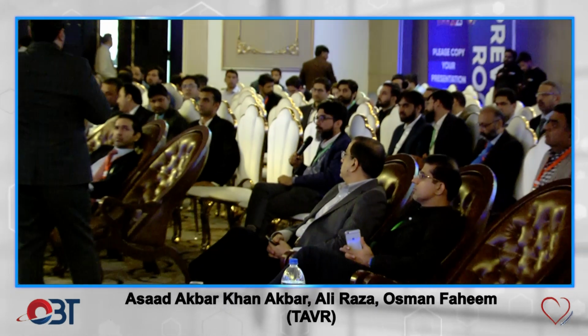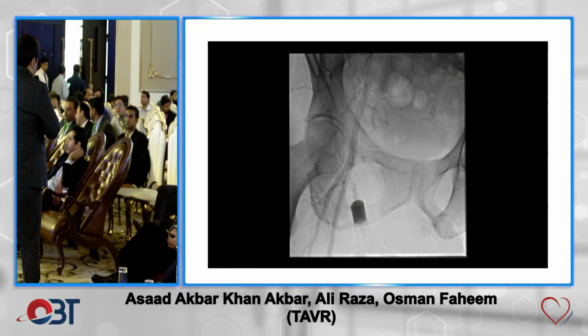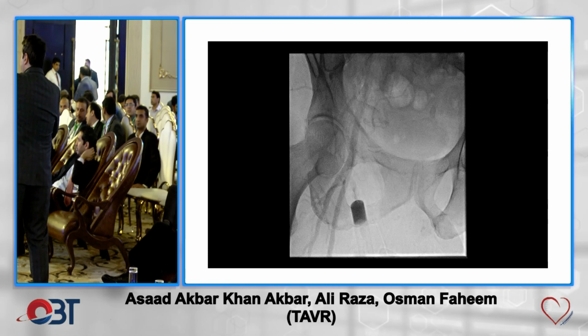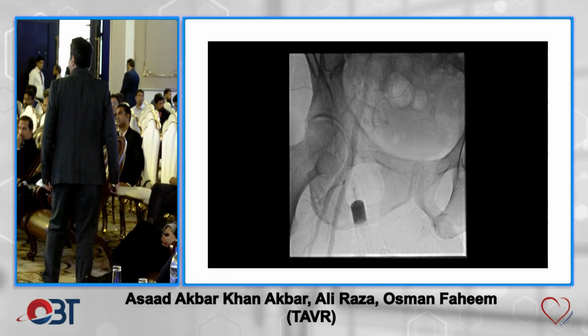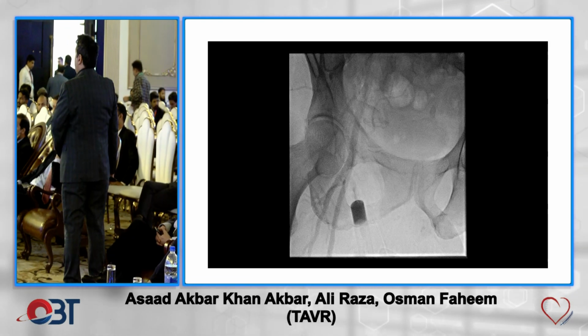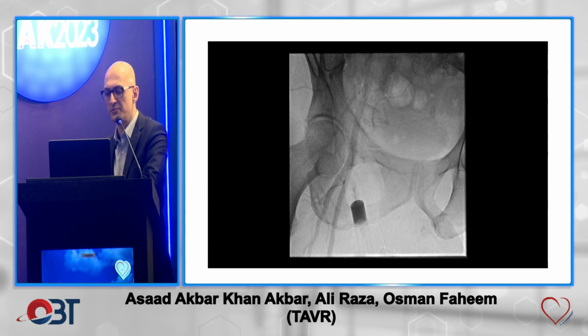My only issue with the bigger patients is the wire of that radial sheath, because it kinks on you when you press on it. So that is a good idea for those patients. Yeah. And the 4 French dilator doesn't take a 5 or 6 French sheath wire. So you have to use a 4 French wire, upsize the sheath. So it is a bit of a step.